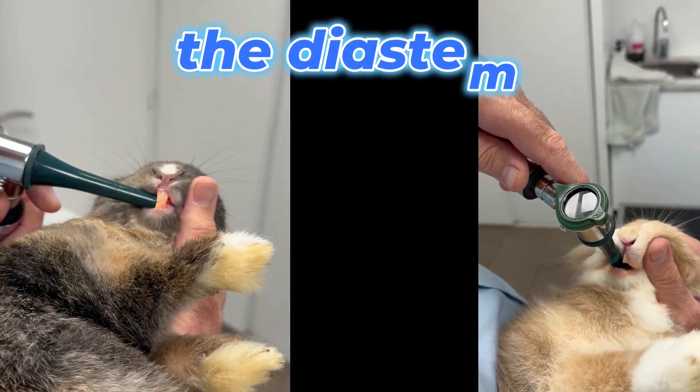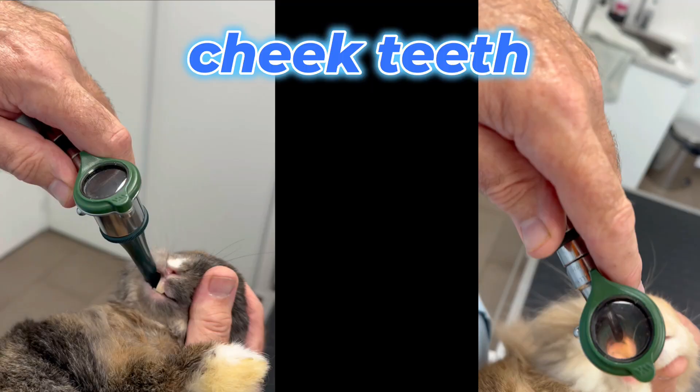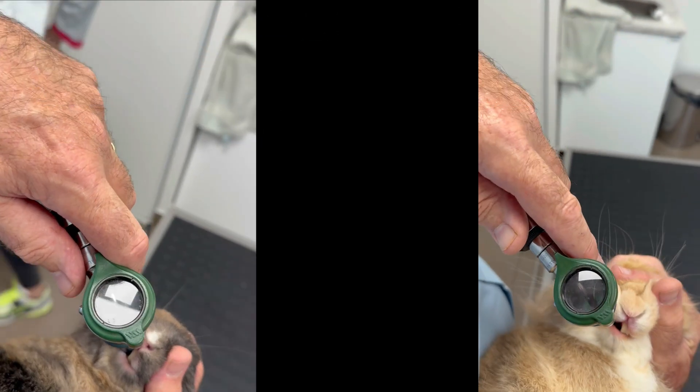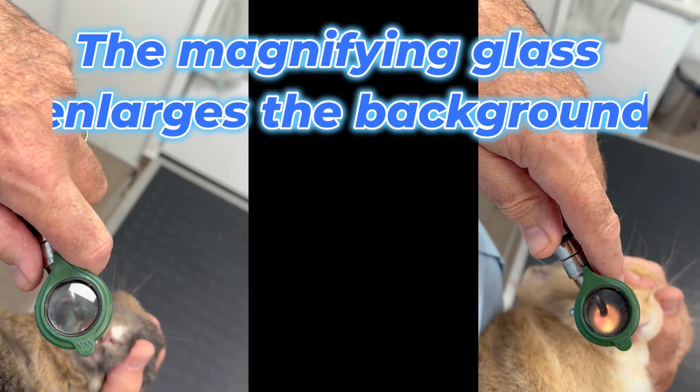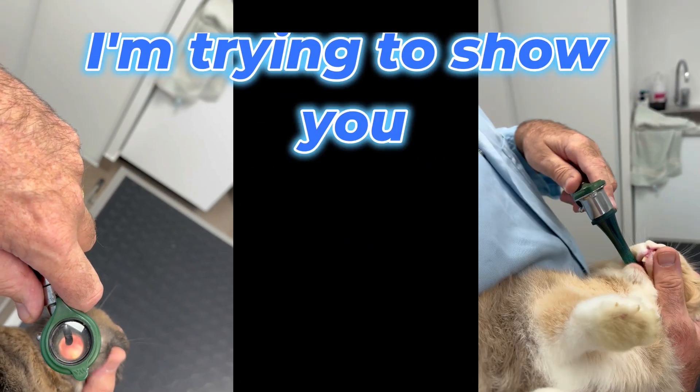I'll start again — can you see that? There's her paw in front. Now we move on to the lip here, in the zone of the diastema. And now we're able to look at these little back teeth — the jugal teeth, cheek teeth.